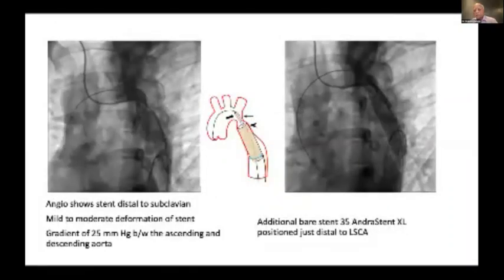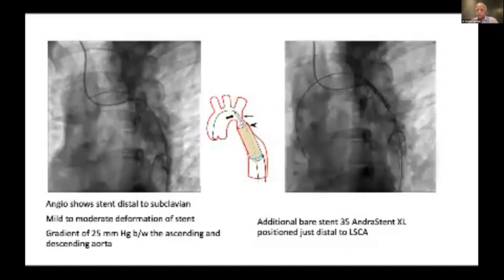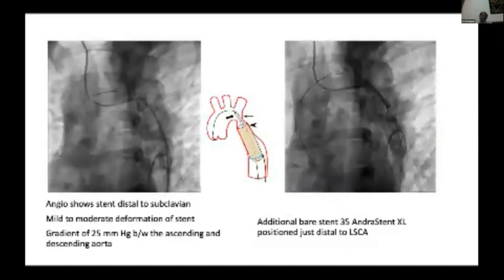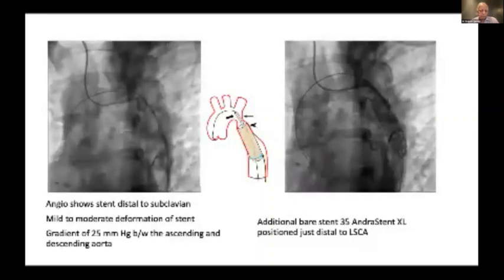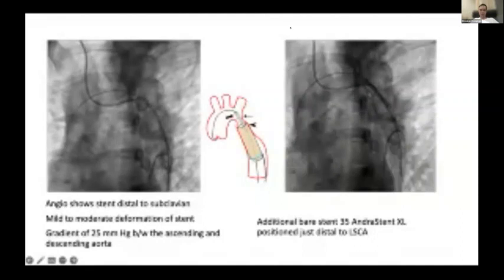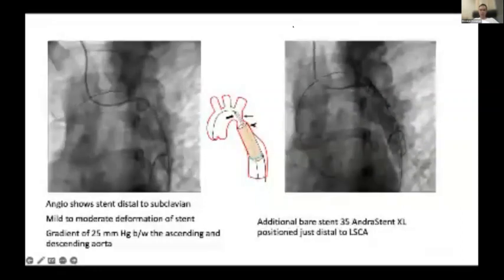Well, we have gone a little bit more proximal still with the balloon, not inside the stent, and that's helped to bring it down. Yeah, I think so. Let's say if you're going to do this case a few weeks after implanting, will you consider using balloon techniques to pull it back first, or use what Deepa's team mentioned?